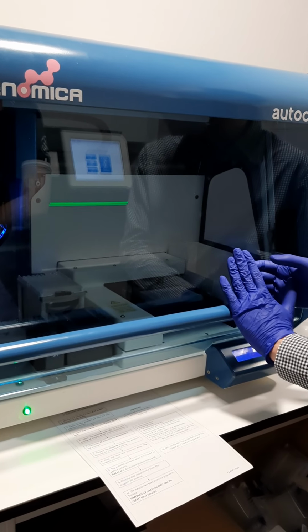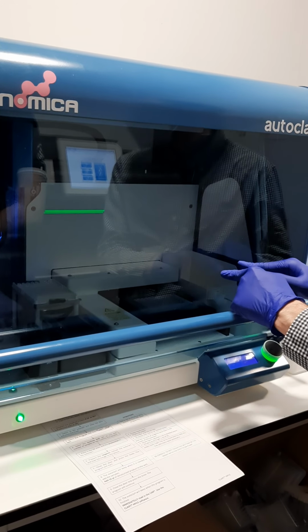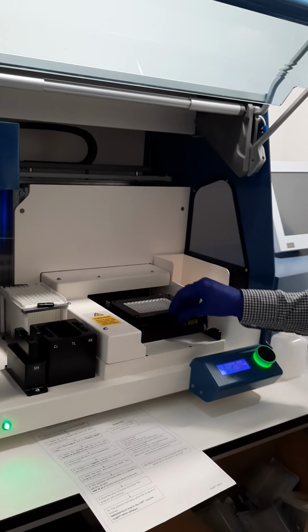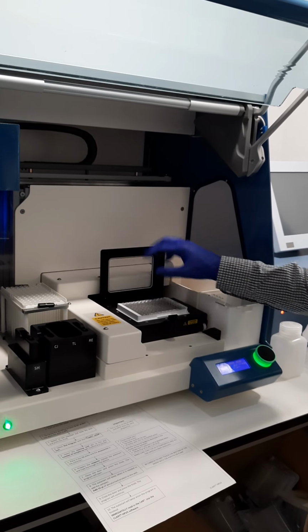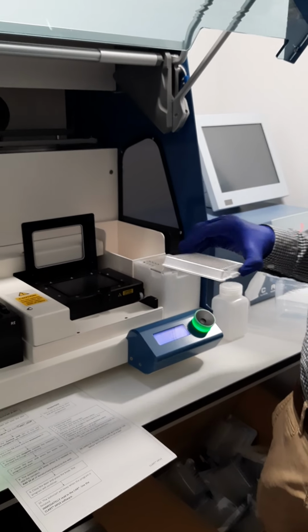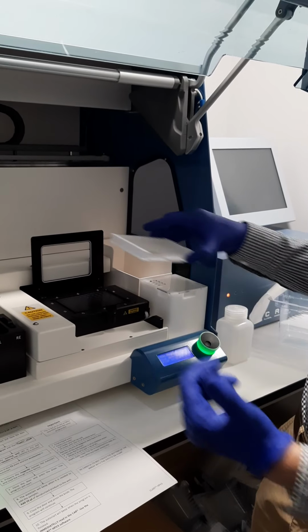When the hybridization solution is added, it's going to beep. It means that we open the door and add in these wells the PCR product. Okay. In this case of HPV, we are going to add in each well, this is for one sample, for another sample, for another sample, 10 microliters of the amplified product of the PCR. Okay. Just add here.